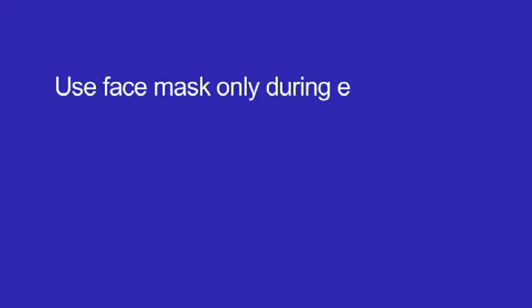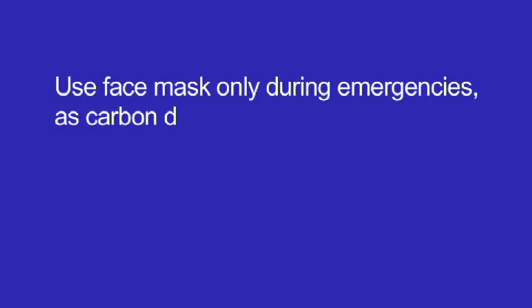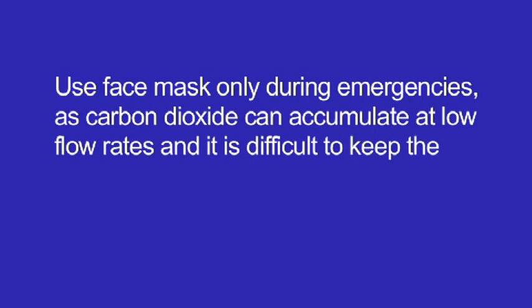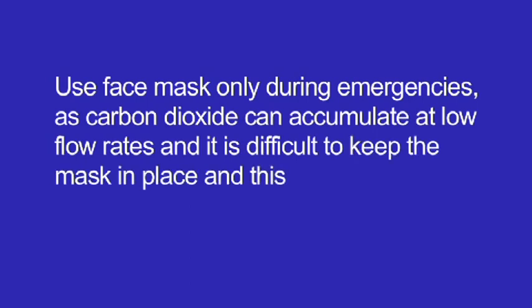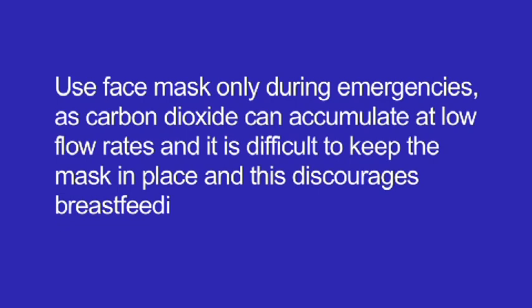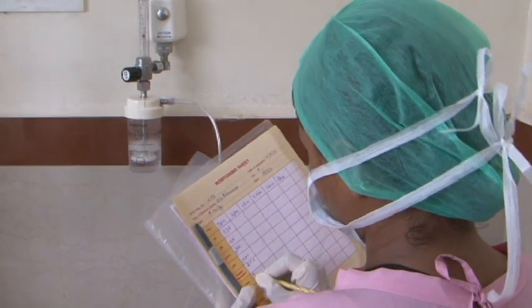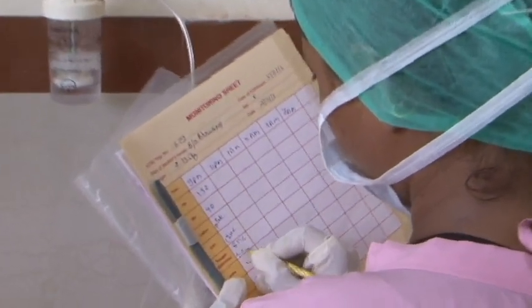Use face masks only during emergencies, as carbon dioxide can accumulate at low flow rates and it is difficult to keep the mask in place, and this discourages breastfeeding. Record time and rate of oxygen administration.